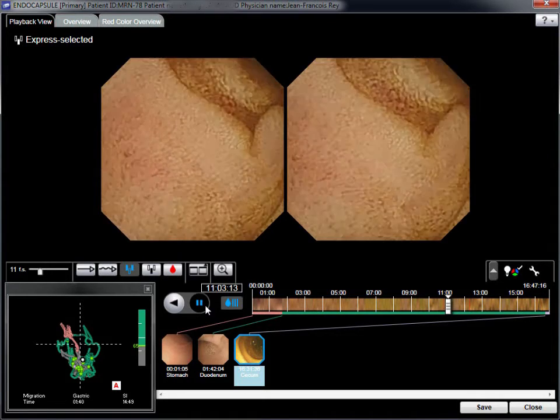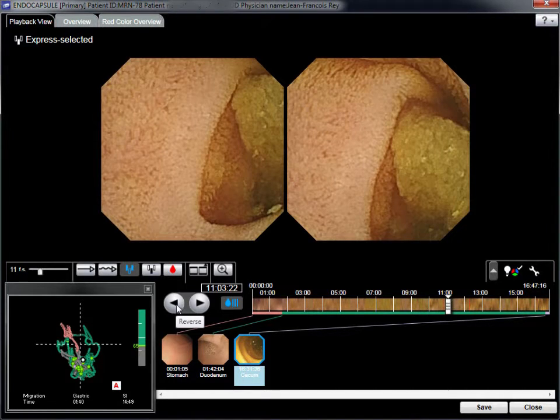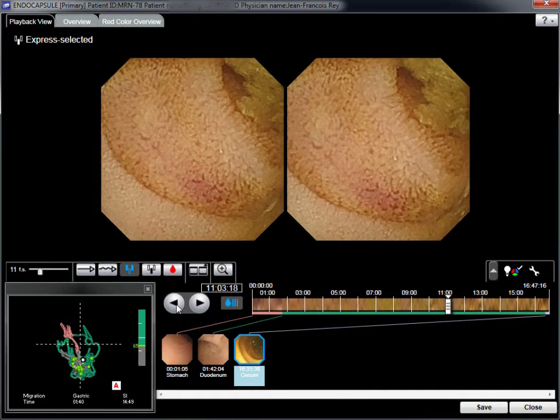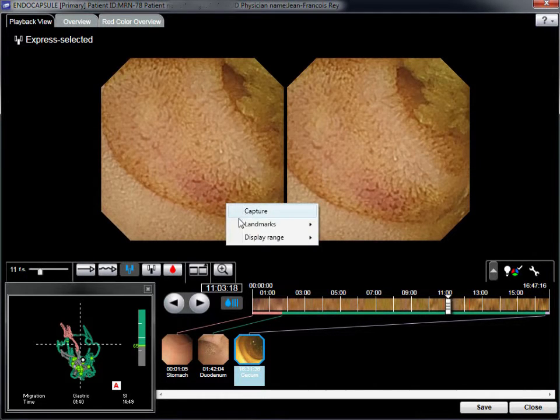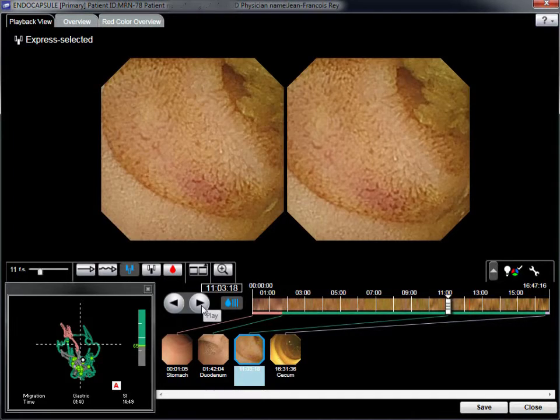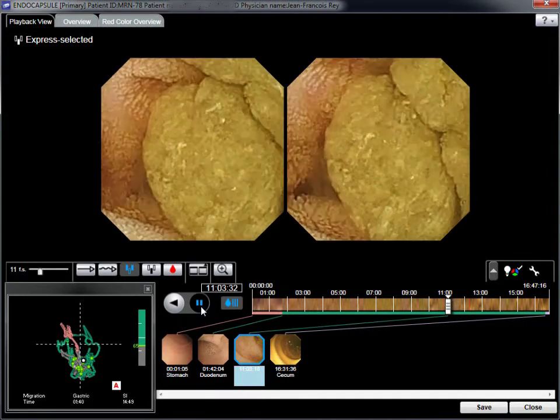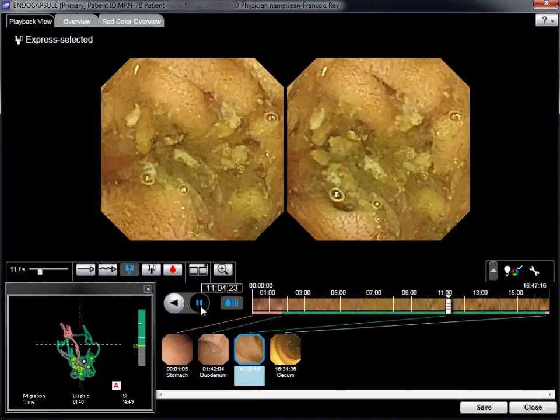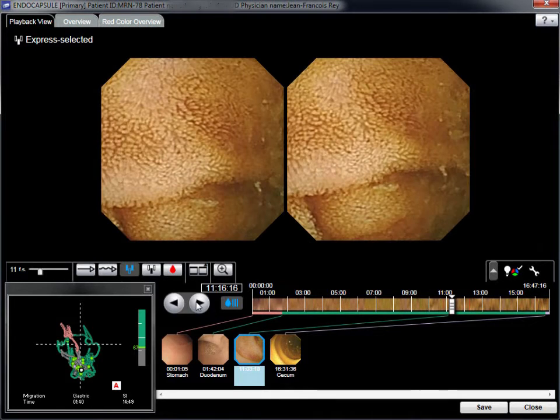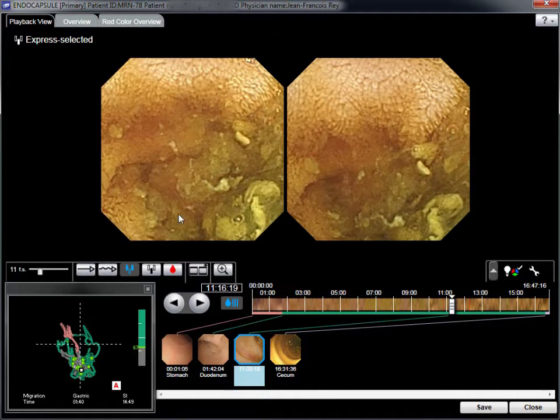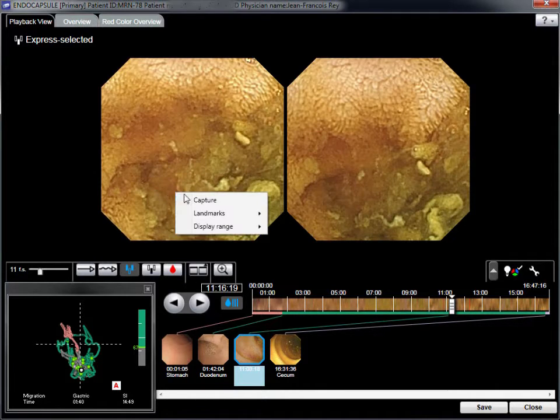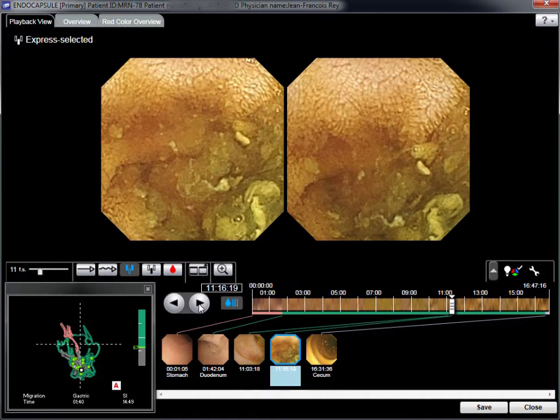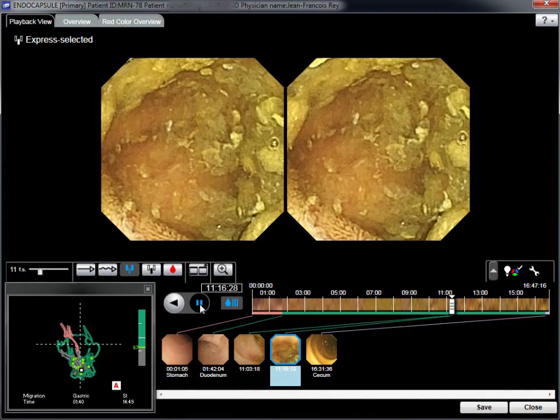Minor inflammation is clearly visible in the distal part of the ileum and is captured at 11 hours 3 minutes from the beginning of the video capsule recording. External protrusion is suspected in this picture, with debris trapped in the ileum lumen. Also, mucosal redness is apparent.